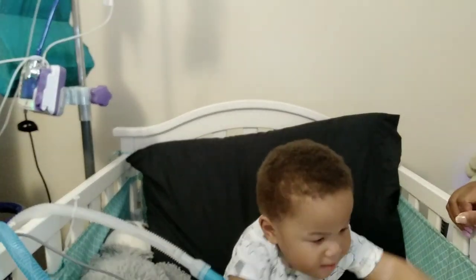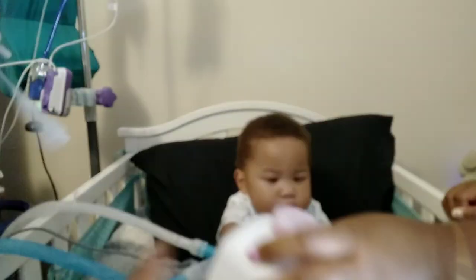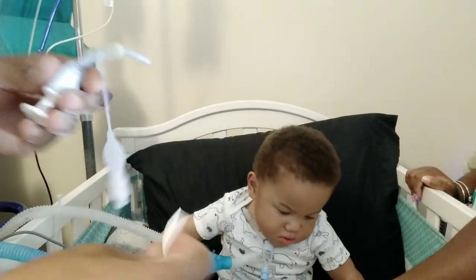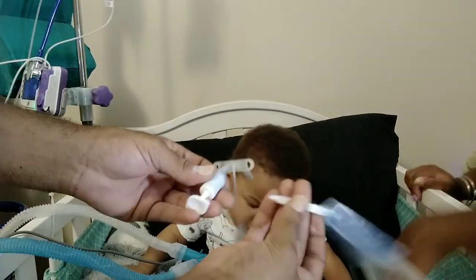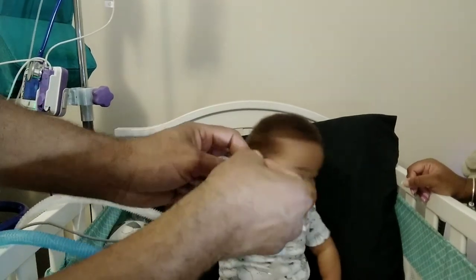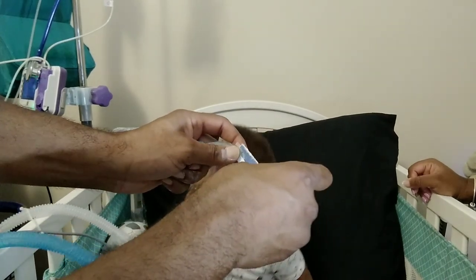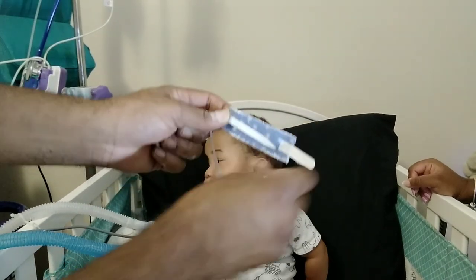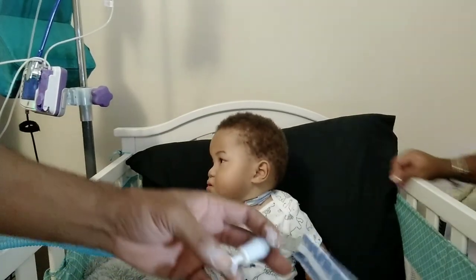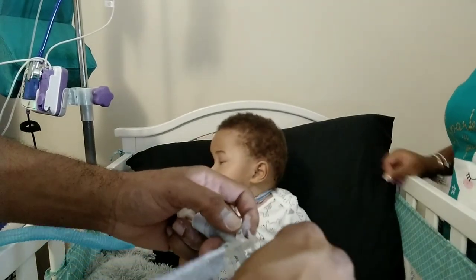It's the same way as doing the little ones, the slim ones. She likes the shoulder side to her side, so that's what I do — I put it to her side. I don't need to see my face or anything like that this time, it's okay. We want you guys to learn about the trach — it's cool to learn about us, but we really want you guys to learn about the trach.